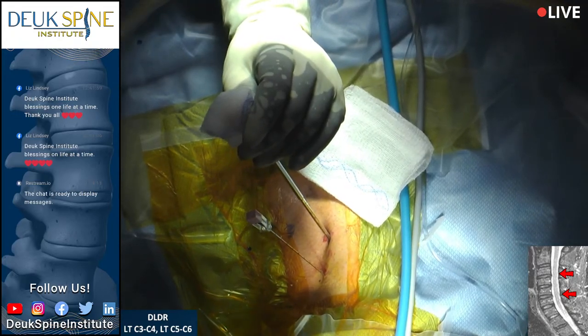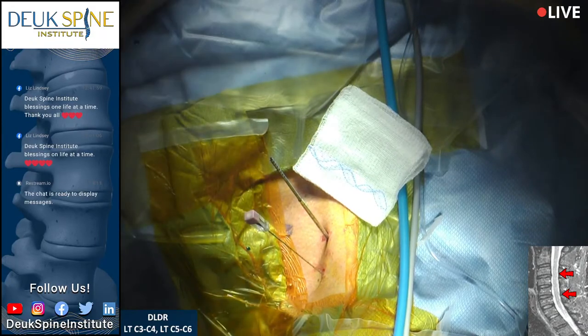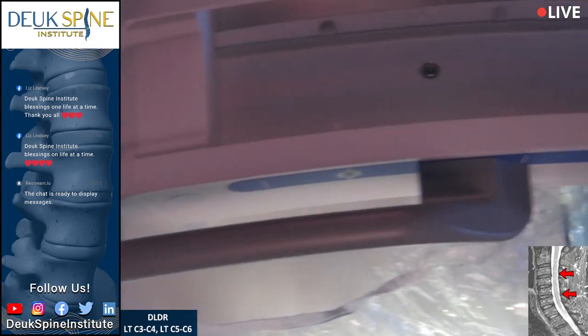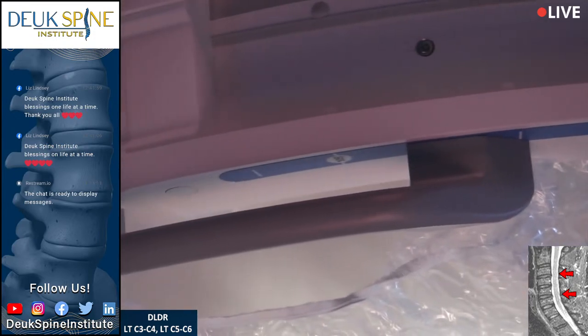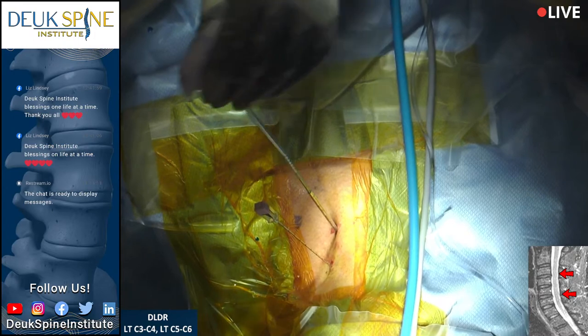We're going to go through the 5-6 disc. On the lateral view it looks like we're taking up a lot of the disc, but on the AP you realize how small the tube is relative to the volume of the disc itself. Show them the disc side to side — that is the uncovertebral joint, from there to there is the disc. The spinal cord lives behind the disc and the nerve root lives in the foramen. Once we pass through the disc, we're going to treat that herniation and clean up the tear in the back of the disc with a laser, which will allow it to heal once and for all.